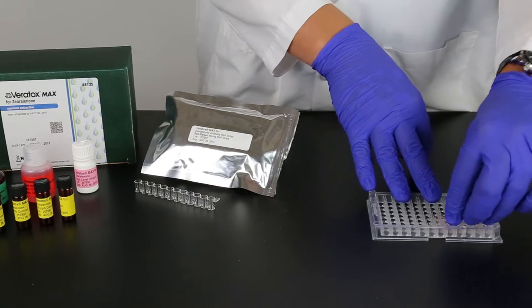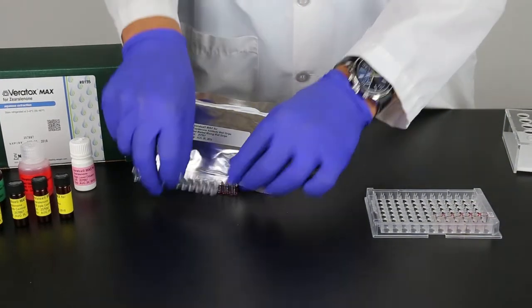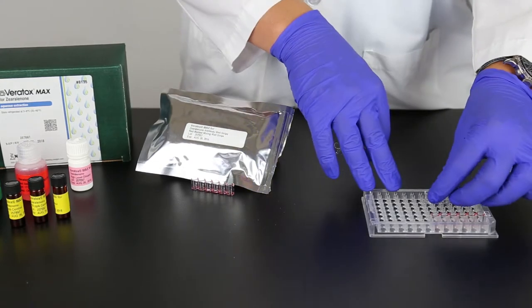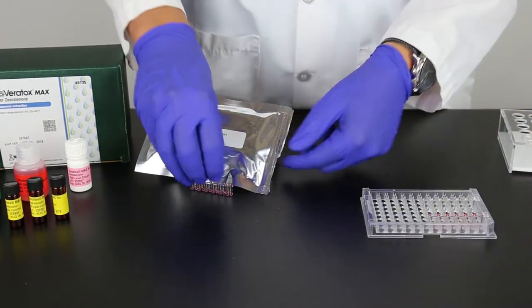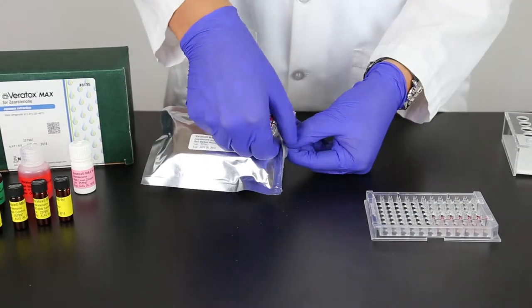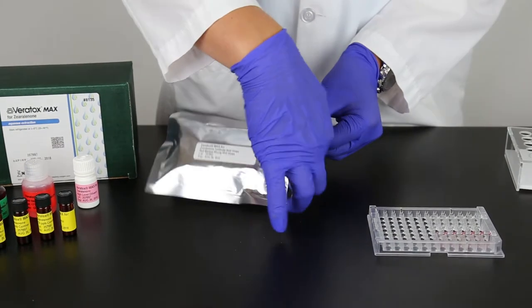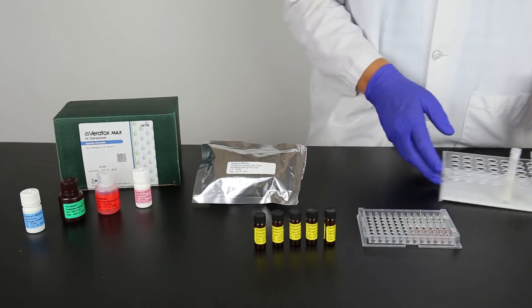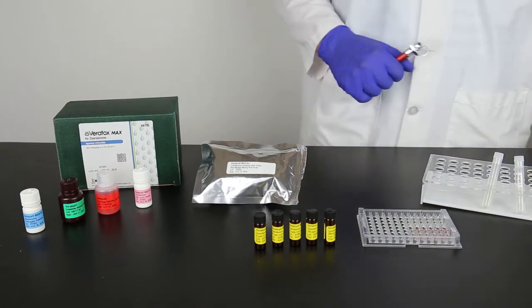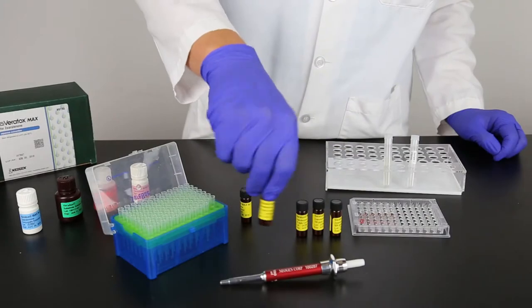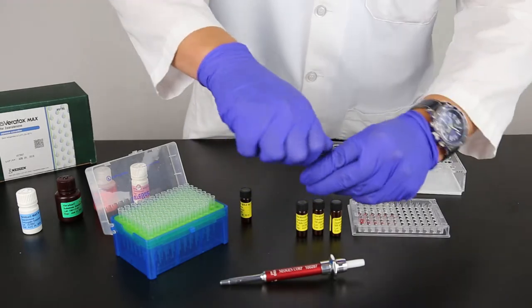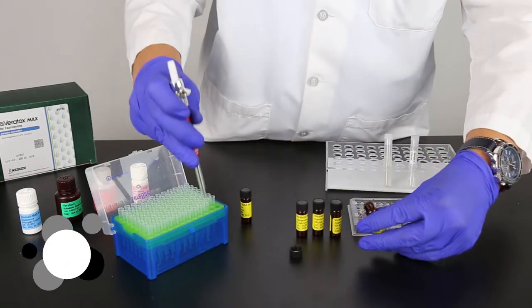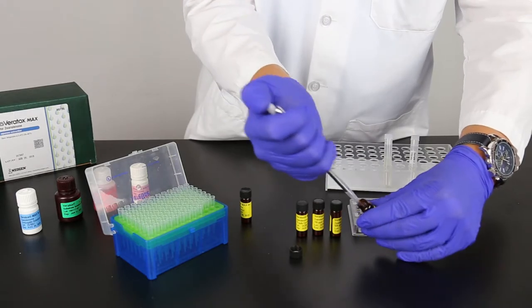Remove one red marked mixing well for each sample to be tested plus five red marked mixing wells for the controls. Remove an equal number of clear antibody coated wells and place both strips in the well holder. Put the controls in order from the lowest to the highest concentrations. Gently swirl prior to use. Using a new tip each time, place 100 microliters of the controls and samples into the appropriate wells.